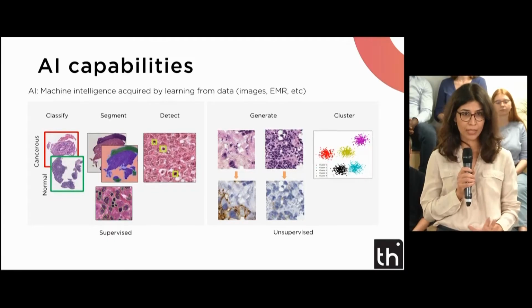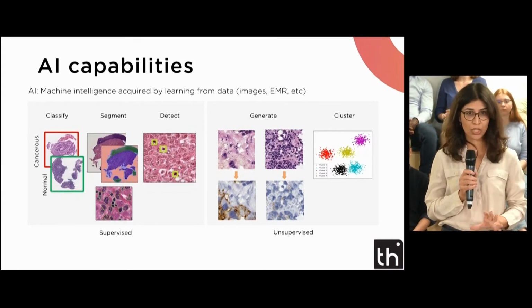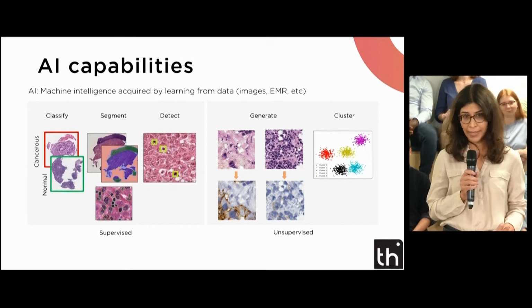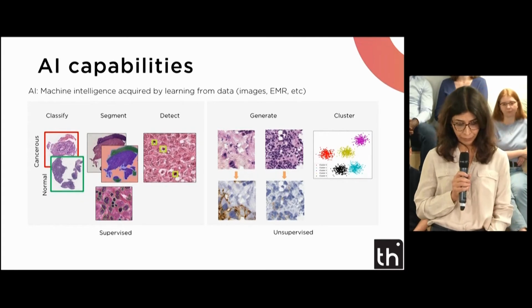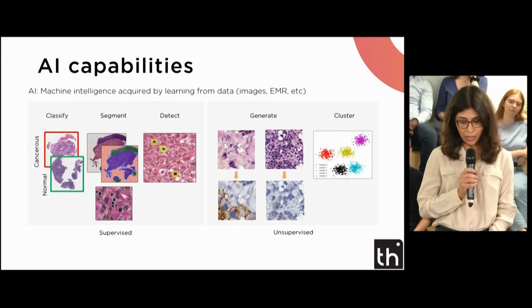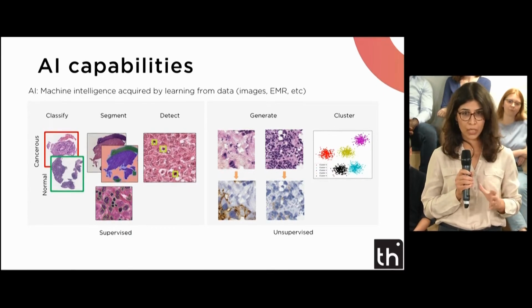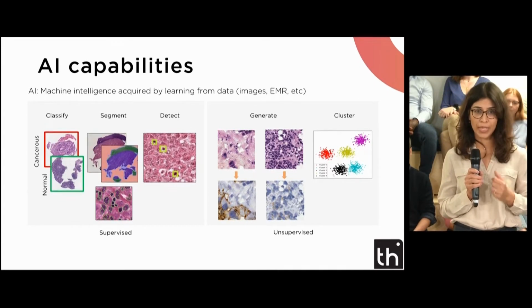So you probably know that AI is a performance system that answers a very precisely defined question. If you want to know if there is any cancer in a given image, AI can do that. If you want to predict patient relapse, AI can also do that. So AI is a very powerful system that acquires its knowledge and its intelligence from data. Data is very crucial in constructing AI systems. So we basically feed this system with thousands to millions of cases, and it is up to AI to find the rules and to find relevant criteria to make a decision.